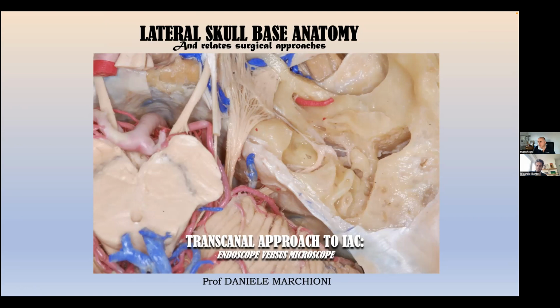And just to show which kind of surgery we had this kind of complication, especially at the beginning when we pushed the endoscope through the cerebellopontine angle. Sometimes we didn't understand if it was hitting the nerve with the tip of the endoscope. But anyway, in those cases, the patient had just a little bit more of a problem, but the percentage is really low, honestly. And comparing with the translab approach, there is no difference, honestly.